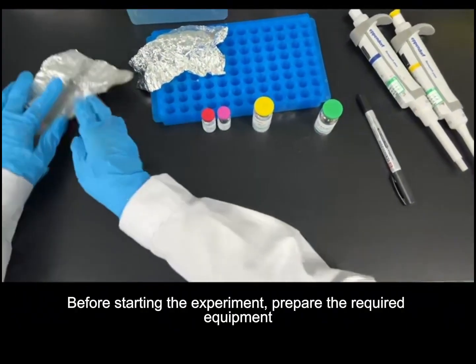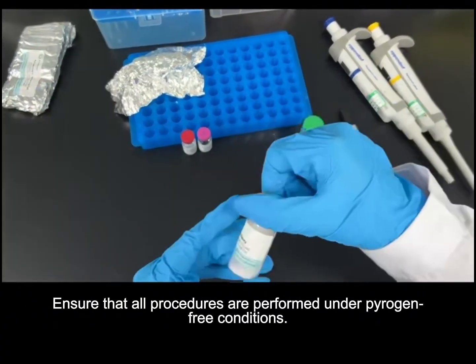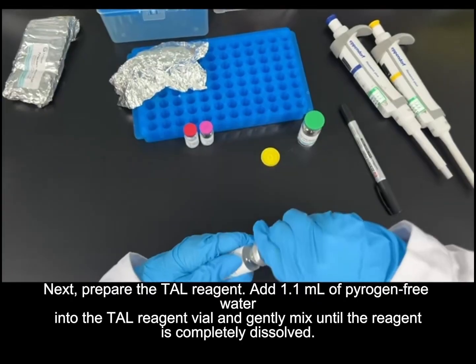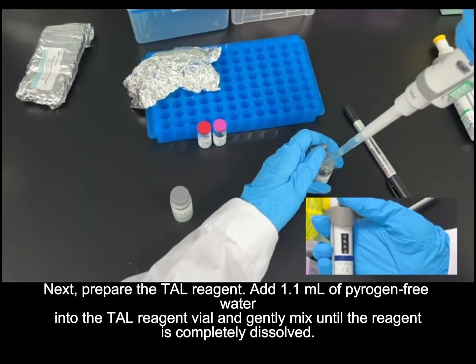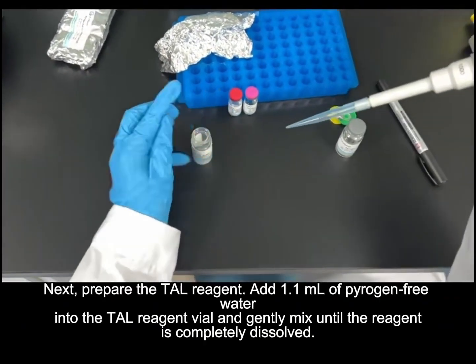Before starting the experiment, prepare the required equipment. 1. Micropipettes. 2. Gel Clot TAL reagent. 3. A shaker or vortex mixer. 4. A 37°C water bath. 5. Pyrogen-free reaction tubes. Ensure that all procedures are performed under pyrogen-free conditions.